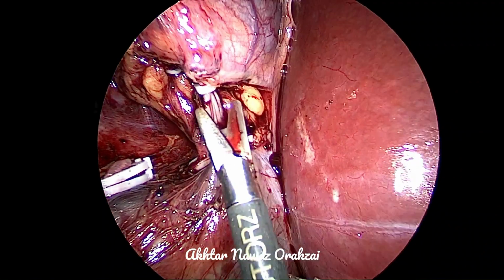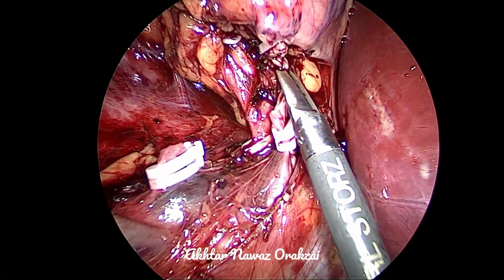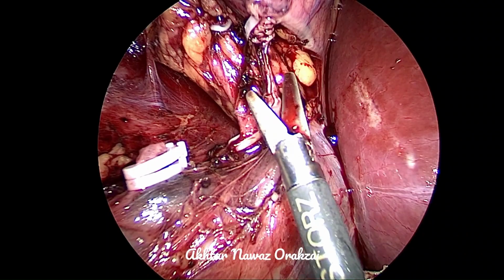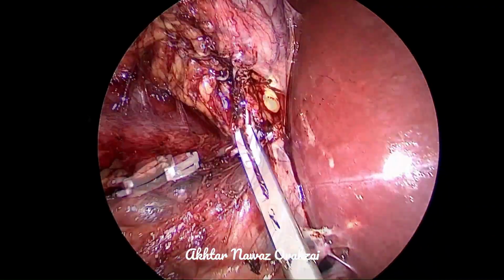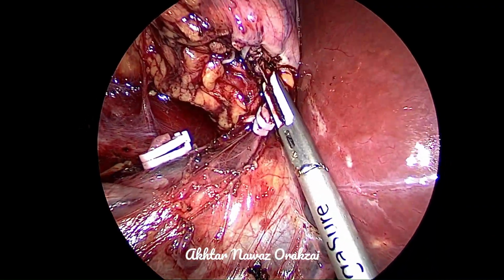Another important thing is that do not cut the vein or any other vessel in one go. Just open the lumen half so that you can see if there is any bleeder. And the second thing is that we usually apply these Hem-o-lok clips after stretching the pedicle.